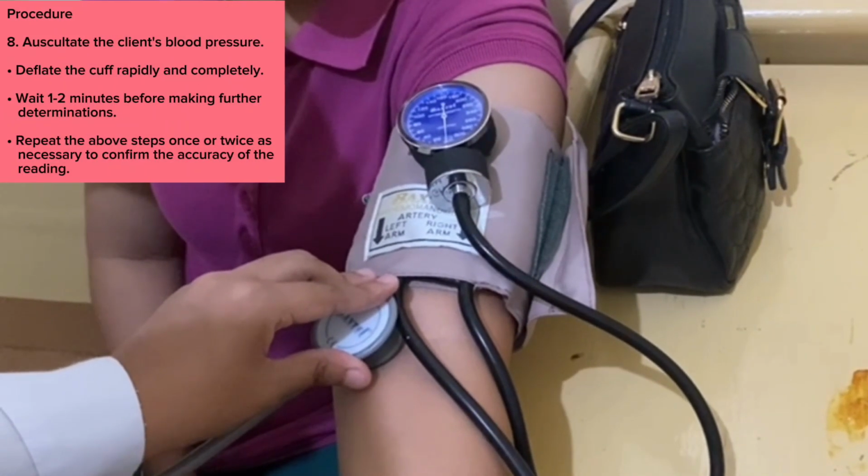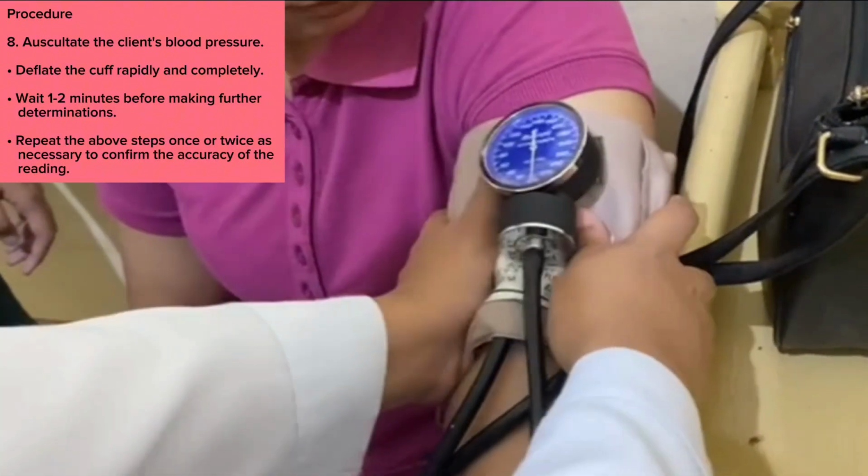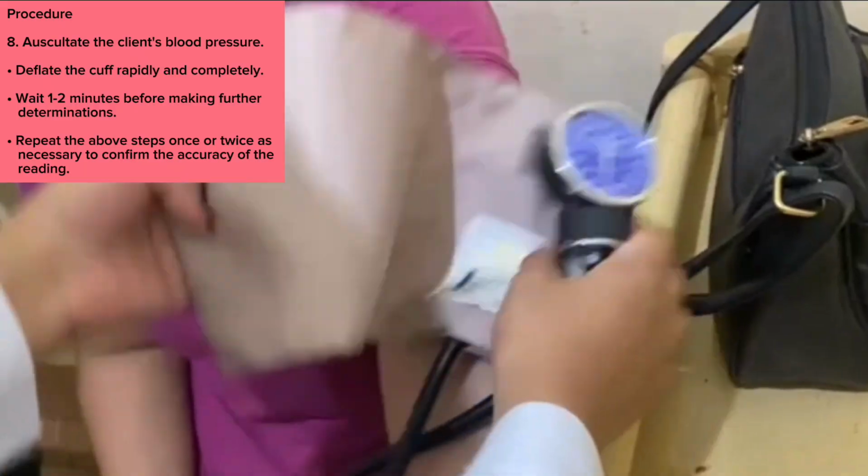Deflate the cuff rapidly and completely. Wait 1 to 2 minutes before making further determinations. Repeat the above step once or twice as necessary to confirm the accuracy of the reading.